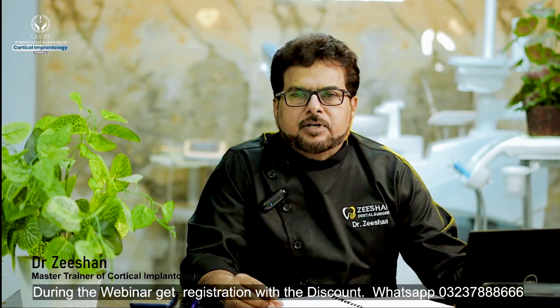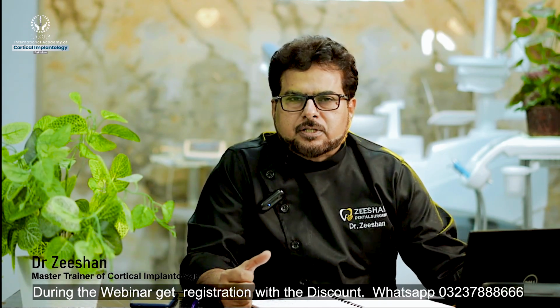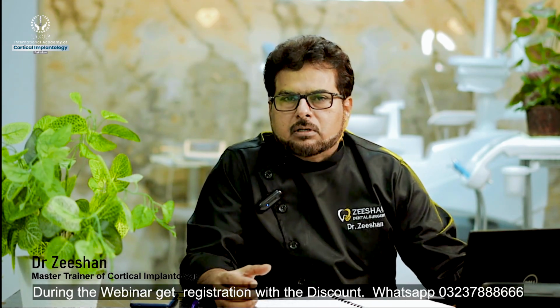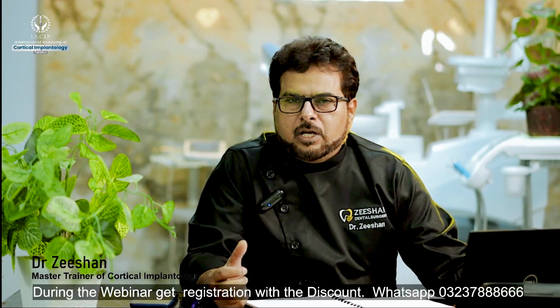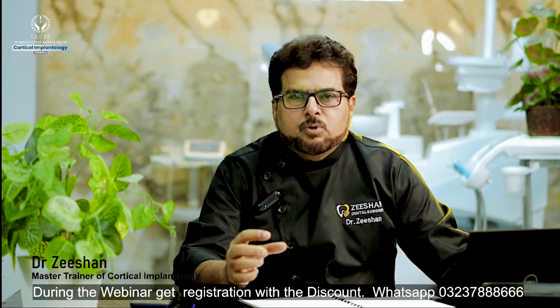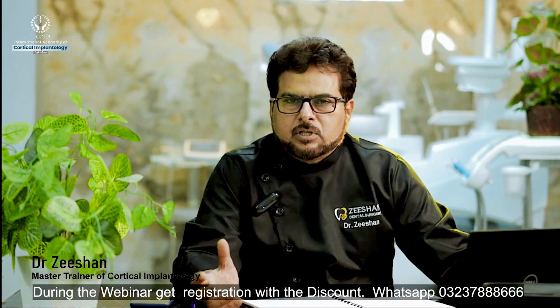Availability of bone is less, so we are going to choose a different system of implant which provides us more primary stability while placing the implant either in an extraction socket or in a healed socket. So we need a system which allows us to achieve the primary stability by placing the implant in less bone, less quantity or quality. Both are lacking.